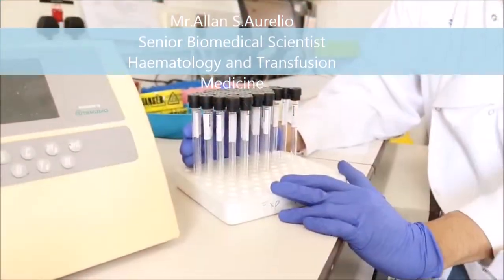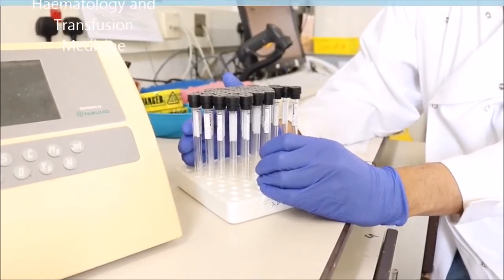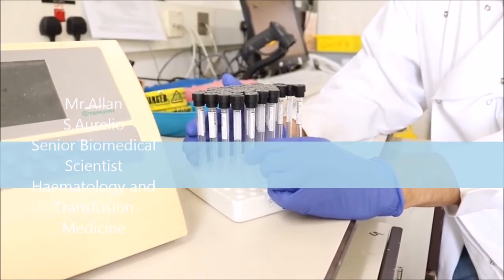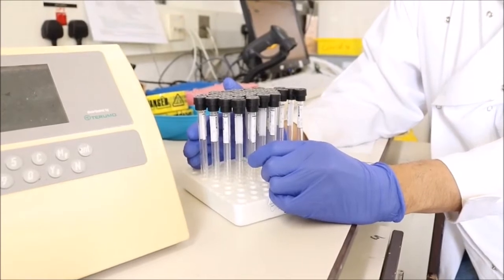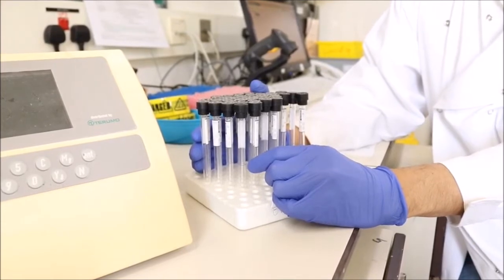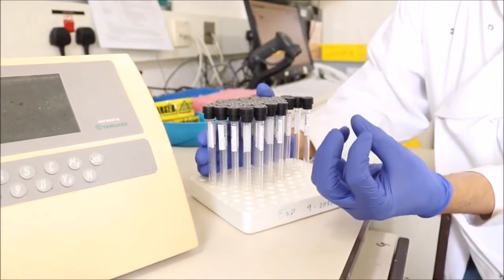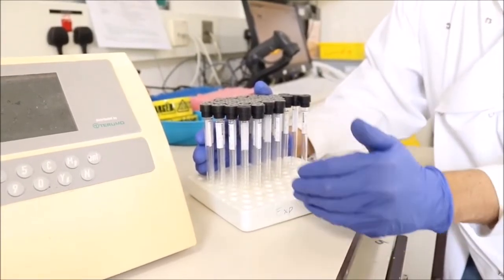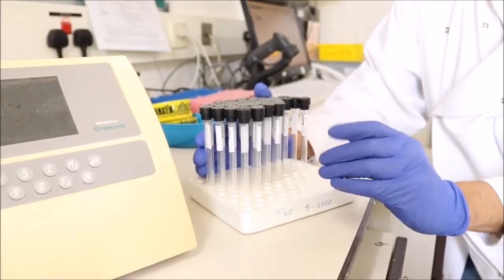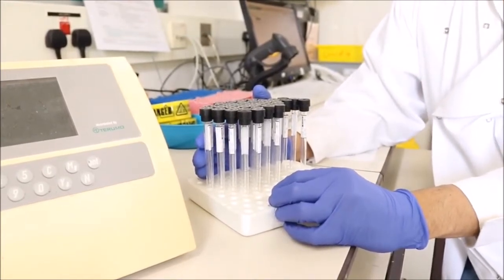The test that we usually perform in this lab is the ESR, otherwise known as the erythrocyte sedimentation rate. What this test is basically based on is that we are checking the ability of the red cells to settle at the bottom of the tube. The importance of that is that it gives a non-specific indication.